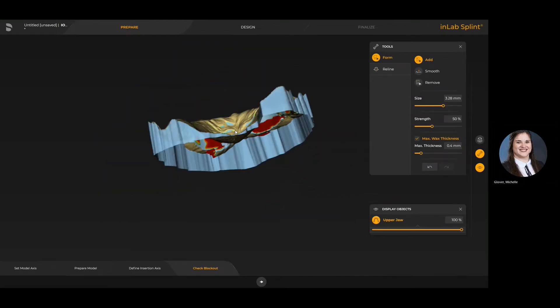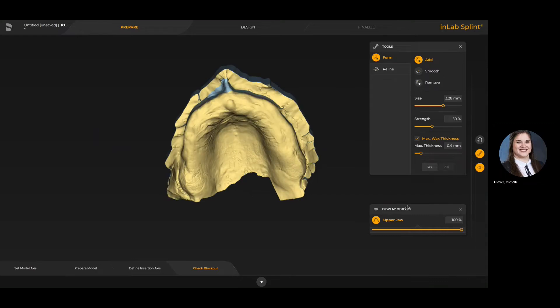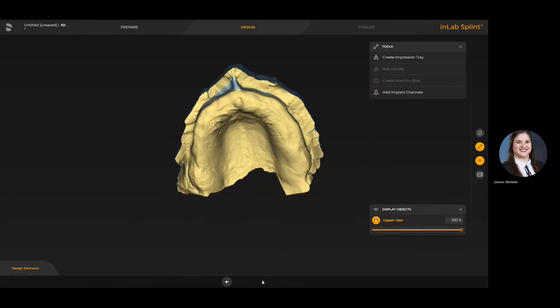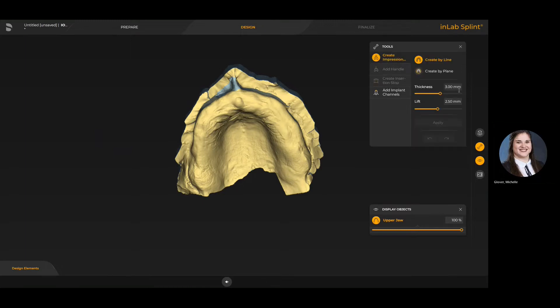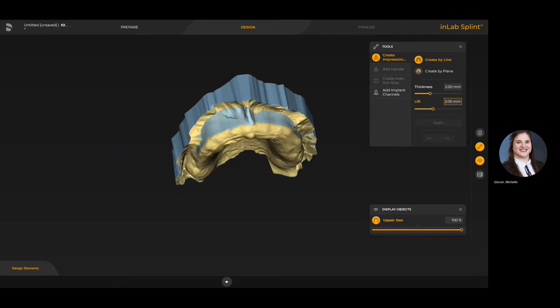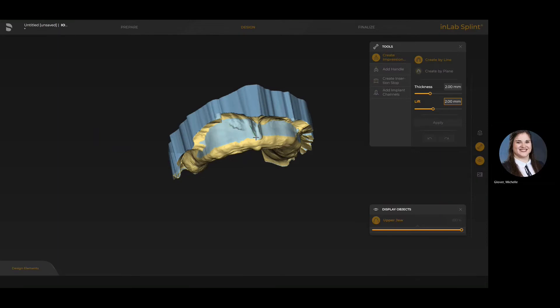Once we're happy with the block out — and the software does a good job of blocking out what it needs to — we're able to move forward to the design step. In the design phase the very first thing we want to do is create the actual impression tray. Once we select create impression tray we'll have the ability to control the thickness, referring to how thick the material will be for the tray, and the lift, referring to how much space we're giving for actual impression material. Once we change those, we can define the borders.